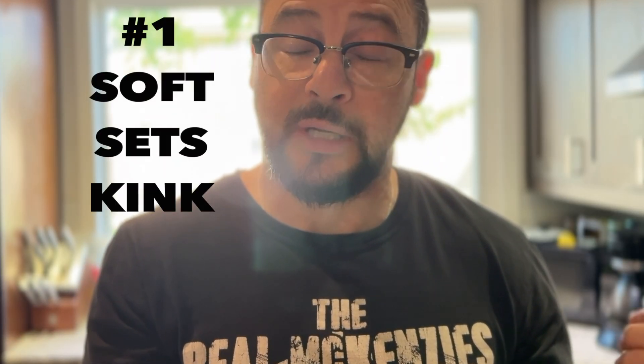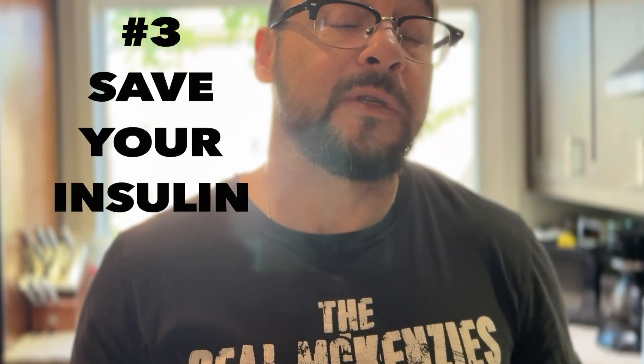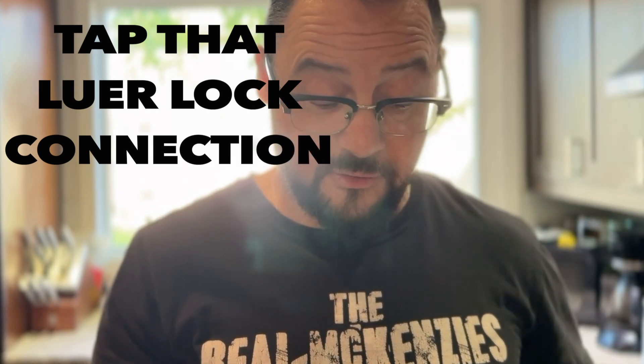So a few tips: Tip one — I use TruSteel because if you have issues with bent cannulas, request a metal cannula; most pumps offer that. Tip two — bubbles, bubbles, bubbles: use room temperature insulin and don't rush the filling process. Tip three — reuse that insulin; if you haven't used the entire reservoir, pull it out like I showed you and save money. And make sure you tap the connection point, because I've been caught with tubing full of air — not good, cosmic high blood sugar.